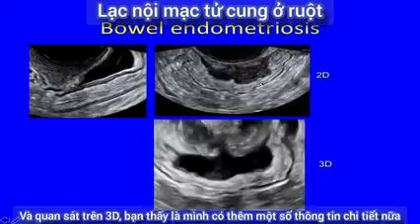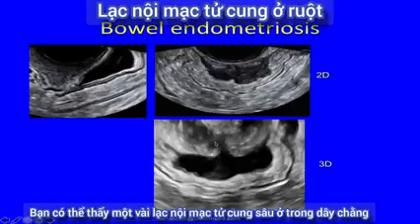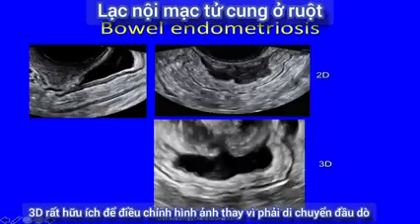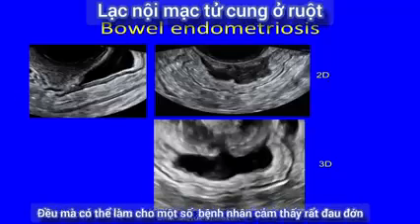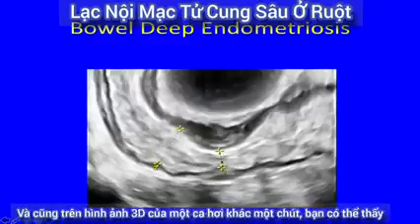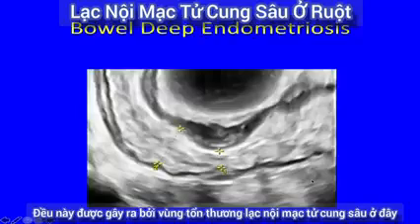When you look on 3D you get a bit more detail — you've got muscularis there and there, you can see some deep endometriosis in the ligaments, and you just get a slightly different view. It's very useful with 3D to be able to manipulate this image rather than move the probe, which in some patients can be very painful. And again, on 3D in a slightly different case, you can see stenosis of the bowel compared to just distally, caused by this deep endometriosis lesion.